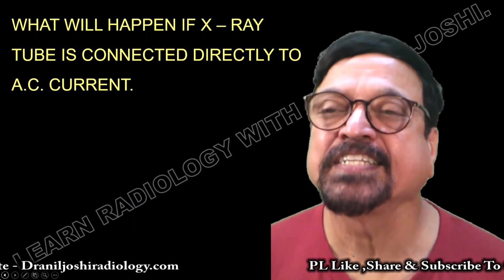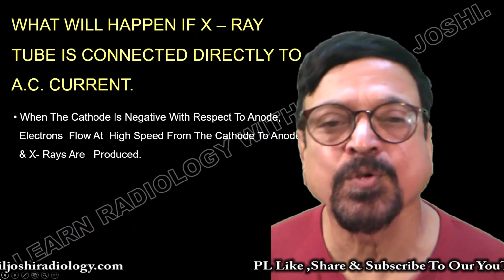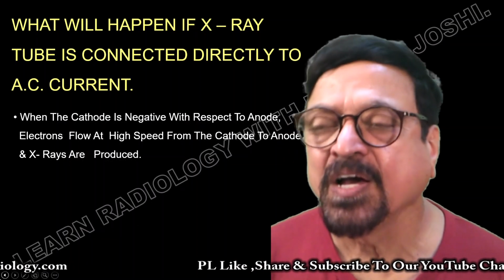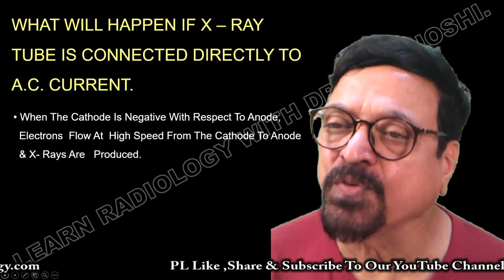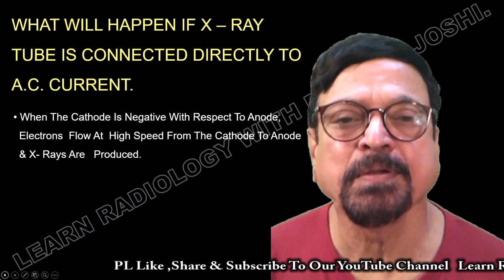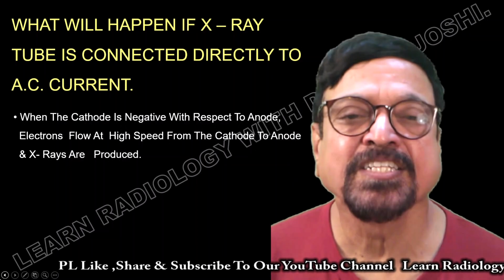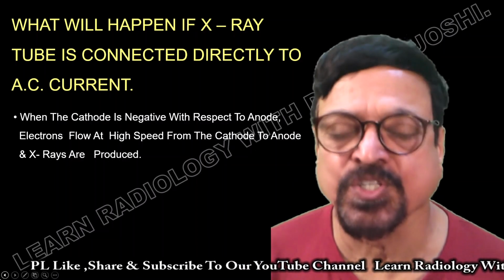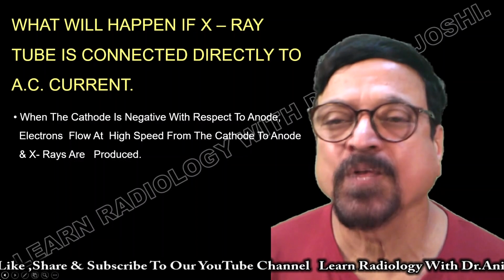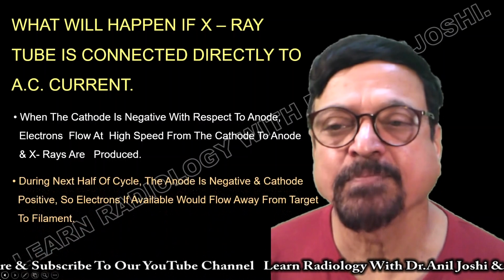What will happen if the X-ray tube is connected directly to the AC current? Now we have seen that you are connecting the two ends of the tube to the two polarities. When the cathode is negative with respect to the anode, electrons will flow at high speed from cathode to anode and X-rays will be produced. Now you have to remember a cycle in which there are upstrokes and downstrokes. Here we are using the upstrokes, but what will happen when there is a downstroke? That is the negative phase, and there will not be any X-ray production.